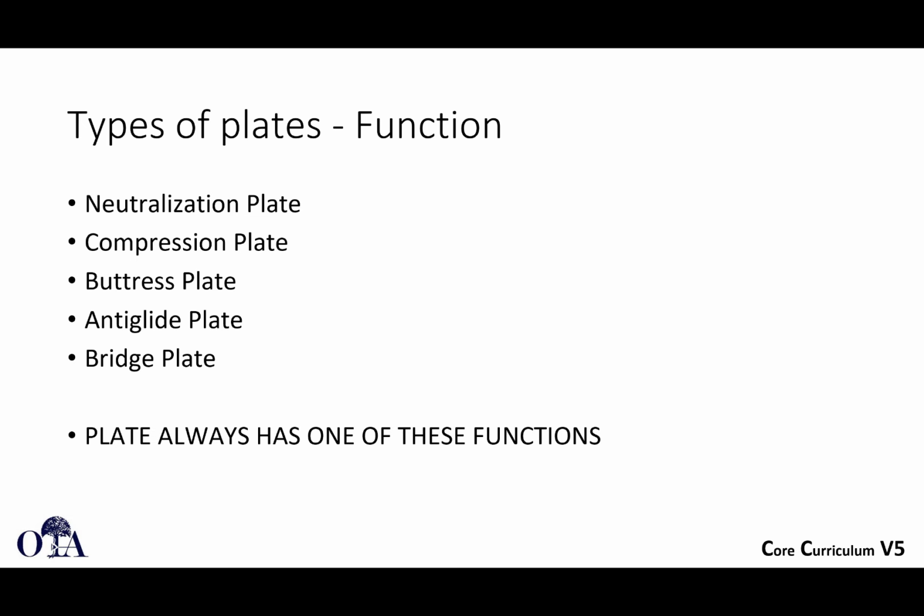So there are different types of plate function. Again, you're not going to ask your scrub tech, can you please give me the compression plate? You are going to take a plate and use it in a compression function or use it to neutralize. Or, if you're going to use a screw, you're going to use a screw in lag technique or position screw. You don't say, hand me the position screw. So similarly, these are plate functions.